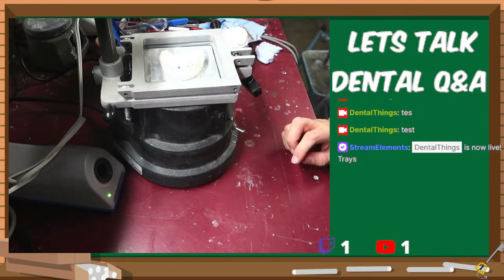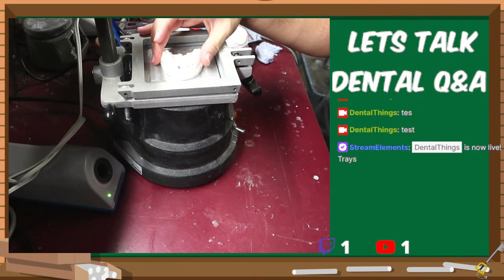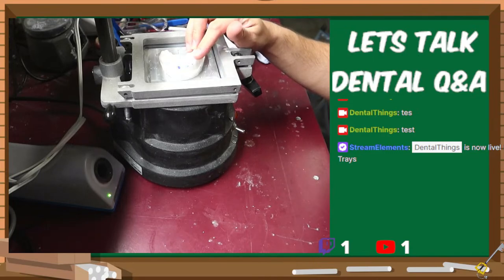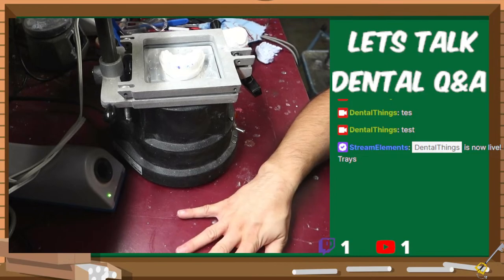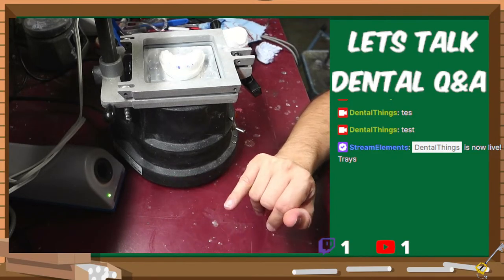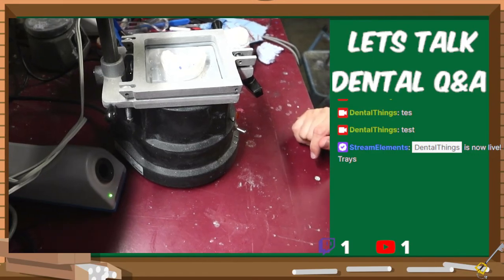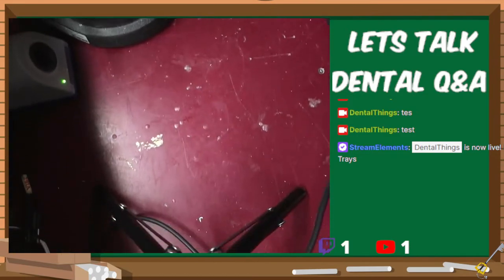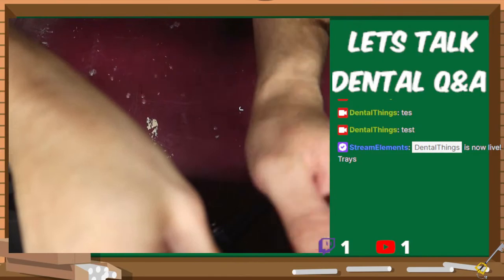Now that I have that done, I can go and have my fan pointed directly at this while this cools. Let that cool down, and then we're going to move back over to the bench, get it cut, get it grinded, get it smooth, have my patient test it out. So at that point, I can go ahead and move back to my bench setting, like I usually do.